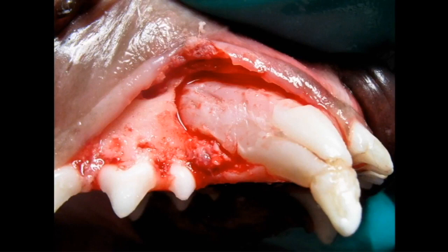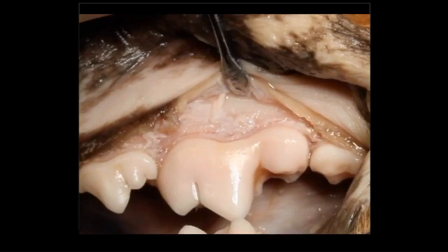Let's go back to the first molar. Here's the flap exposure we would recommend for extracting that tooth, and you can see we've got great exposure. The crowns are facing us, we can see the bone really well, and so now we're prepared to remove bone with our bur to facilitate the next step in that extraction.